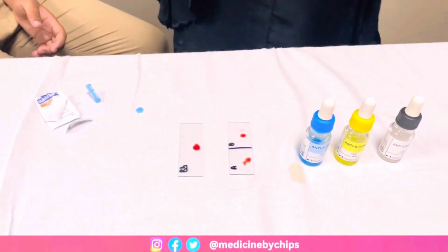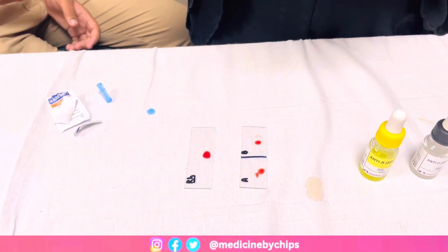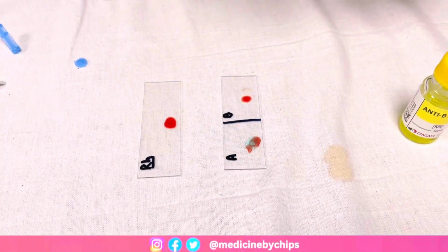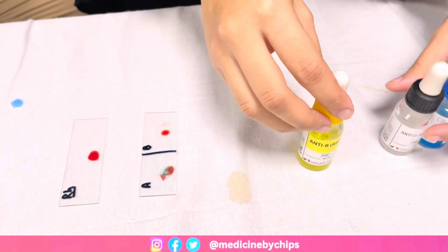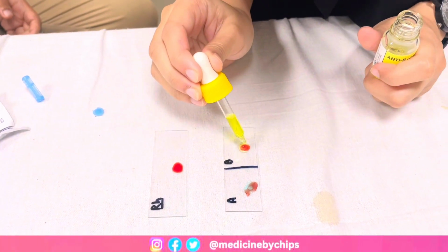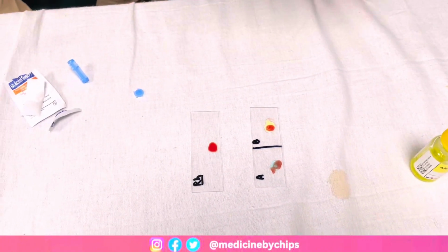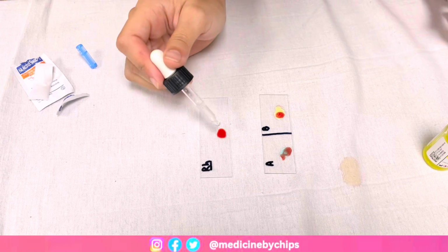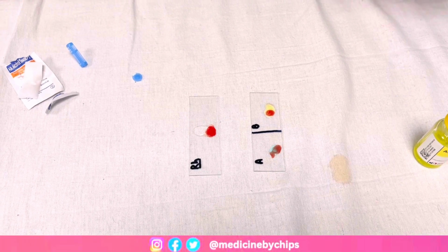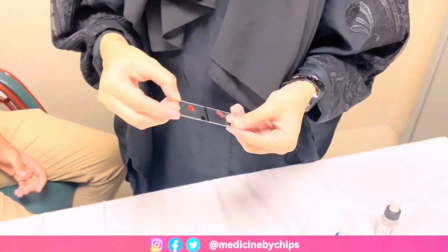Now what we are going to do is add the respective anti-sera on each side. On the antigen A side, we are going to add 1 drop of anti-A sera. Now for B, we'll be adding the anti-sera B. And for the RH side, we are going to add anti-D anti-sera. Now you are going to mix these and check for agglutination.